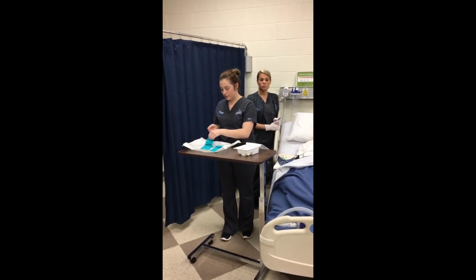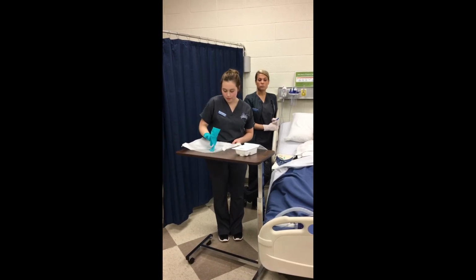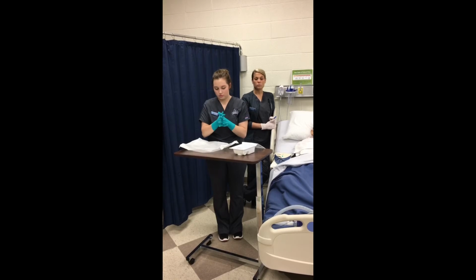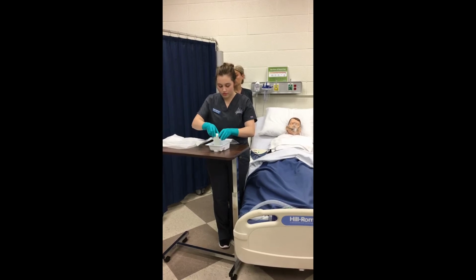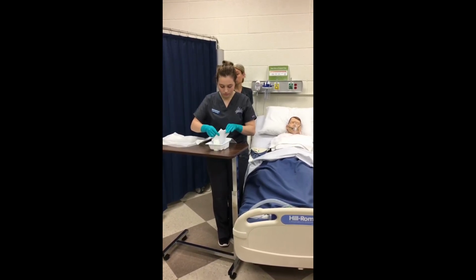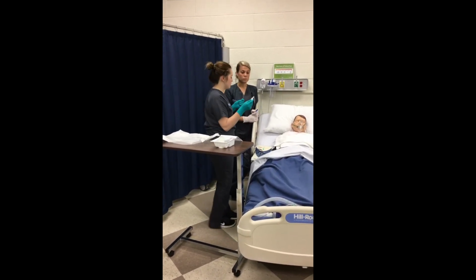I'll start with my dominant hand first, using a hitchhiker's thumb to apply my non-dominant hand. Okay, now I'm going to open my sterile saline, take out the suction catheter, and apply it to the suction tube.